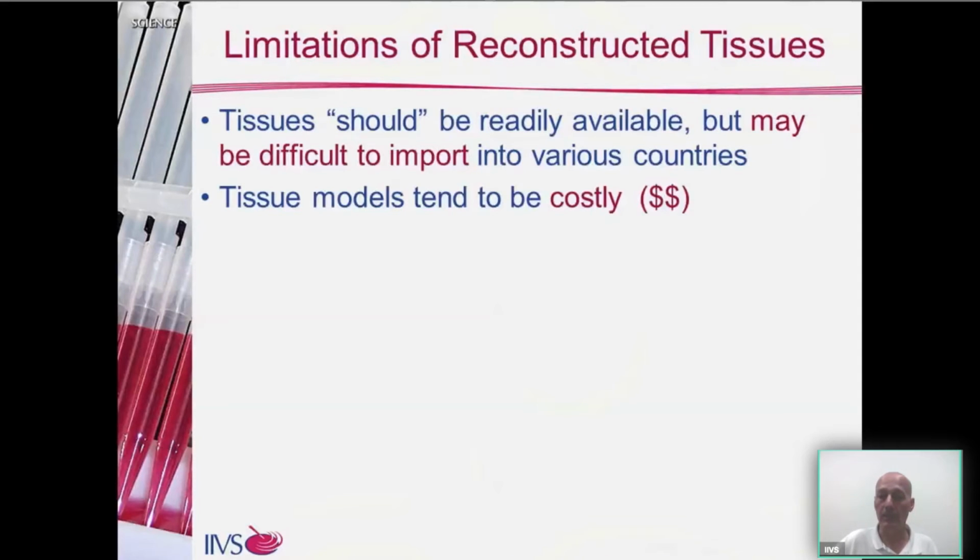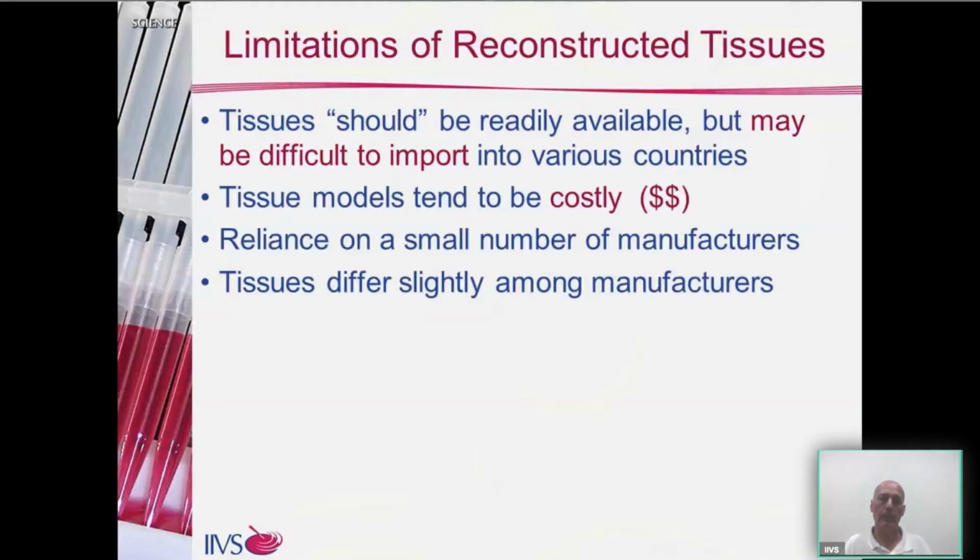Tissue models tend to be costly. They're quite complex tissue systems. We also rely on a relatively small number of manufacturers worldwide for good quality commercial tissue models that are cultured under good manufacturing practices.